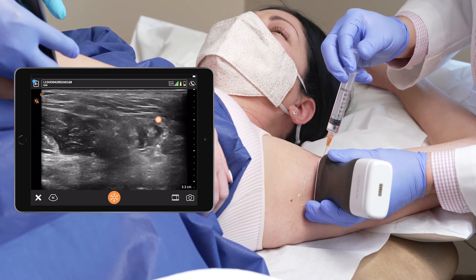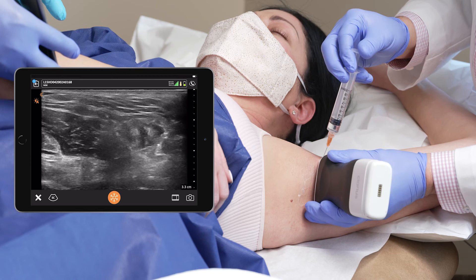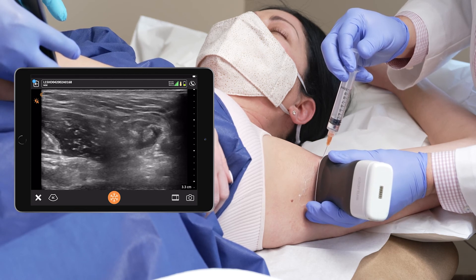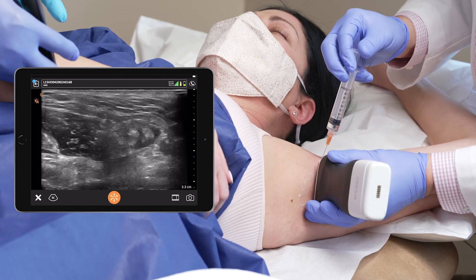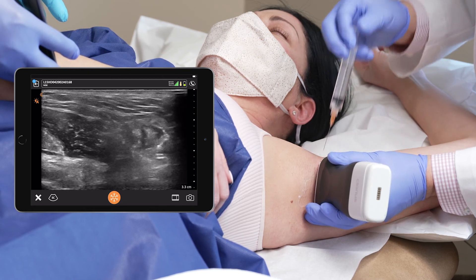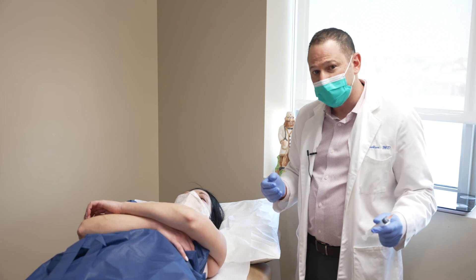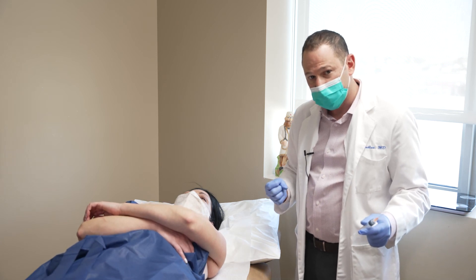So we're surrounding the ulnar nerve with local anesthetic, lateral to the axillary artery. I'm trying a distal approach. We're trying to avoid cervical epidural steroid injections due to the proximity to the spinal cord. So using ultrasound, I'm trying a less invasive means of treating her pain.